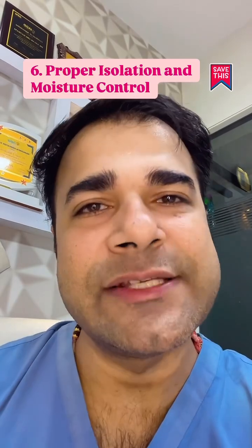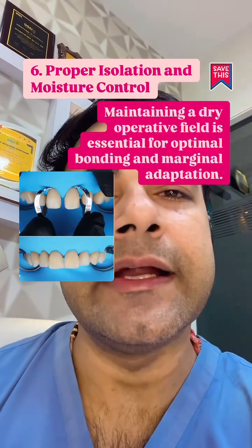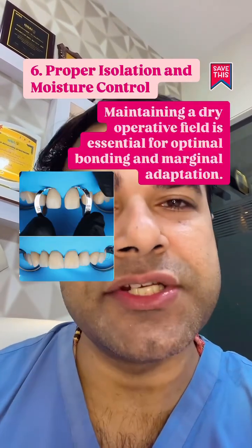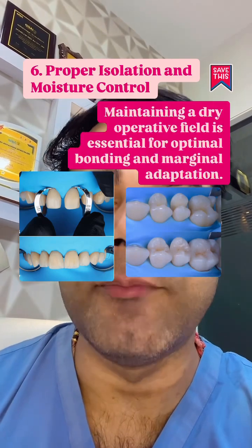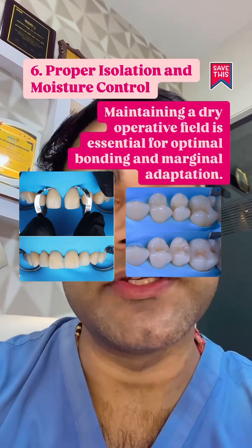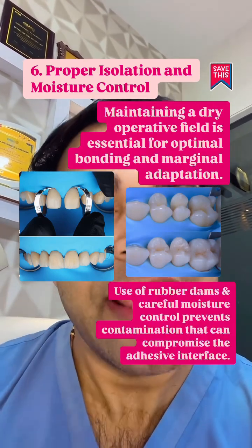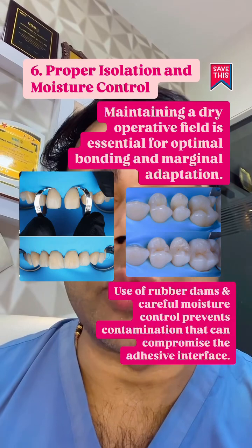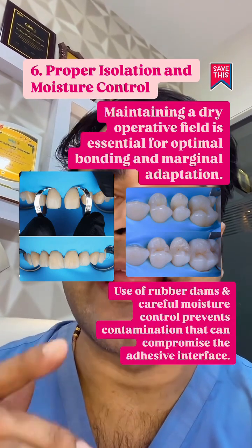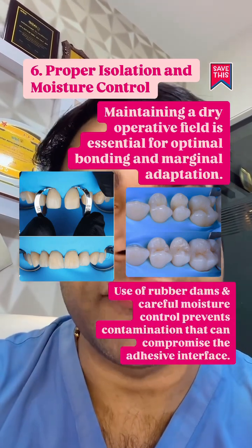Proper isolation and moisture control: maintaining a dry operative field is essential for optimum bonding and marginal adaptation. Use of a rubber dam and careful moisture control prevents contamination that can compromise the adhesive interface.